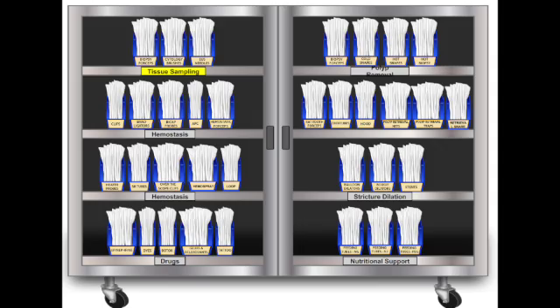Okay. So if the endoscopist is in a tricky spot, like high up in the cardia or navigating that sharp angle in the duodenal bulb, those can be tough. The cap helps stabilize the scope tip, lets them get a really sharp, detailed look at a lesion. Makes sense. And the second use, you mentioned life-saving. Yes, tamponade. In an acute bleed, sudden bleeding, the cap can be gently pushed right against the bleeding site, applies temporary pressure. So it buys you time. Exactly. Buys you, the technician, those vital seconds to get the injection needle ready, or maybe a hemostatic clip.